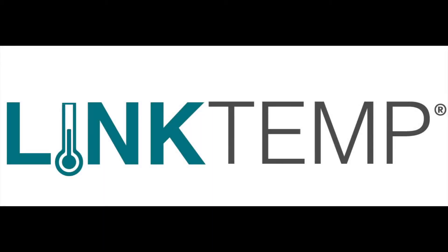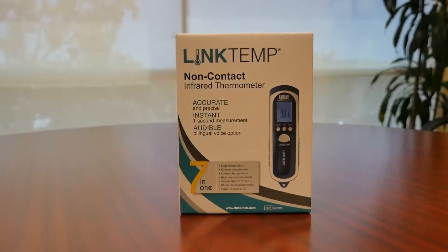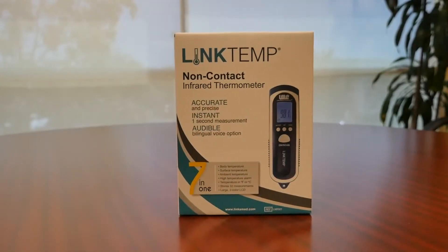Thank you for purchasing the LinkTemp Non-Contact Infrared Thermometer. The LinkTemp Non-Contact Infrared Thermometer is a professional grade thermometer that measures body, surface, and room ambient temperature instantly and accurately.